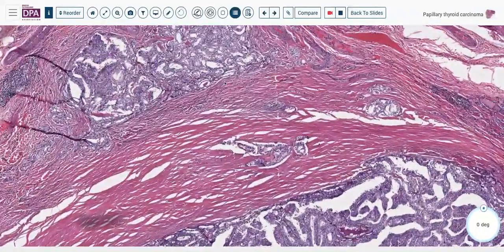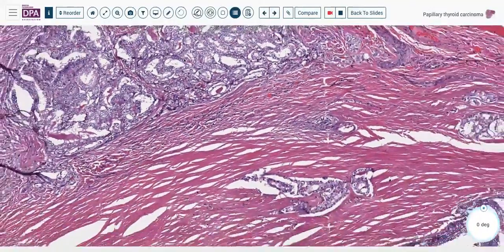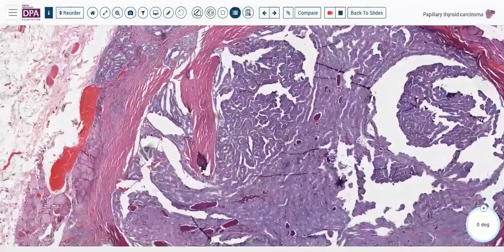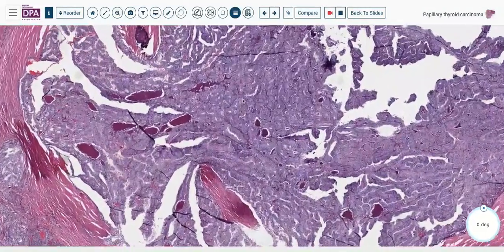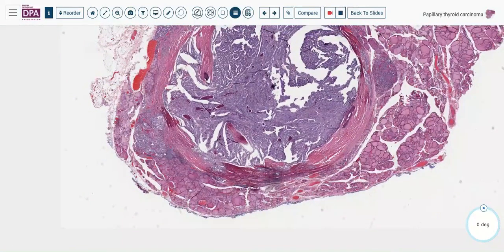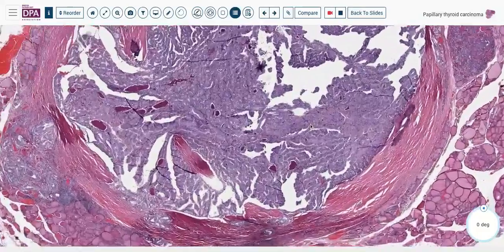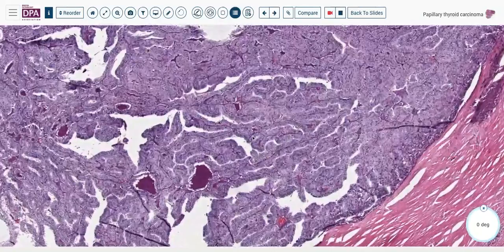And again, it's infiltrated through the capsule, and we've got outer growth here, beyond the capsule going on here. So this is not 100% follicular pattern, even though it was encapsulated and we've got growth and extension beyond there. I think there are some areas here that we should better classify as classical variant.